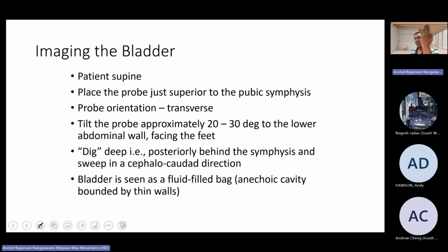What you are able to see, and this is anterior, this is posterior, and you want to fan all the way from anterior to posterior to look at every part of the kidney. After that, you rotate the probe 90 degrees to get the short axis. And here you start scanning from superior to inferior, fanning all the way from the superior pole of the kidney to the hilum to the inferior pole of the kidney. And once again, you're looking for signs of hydronephrosis, cysts, etc.